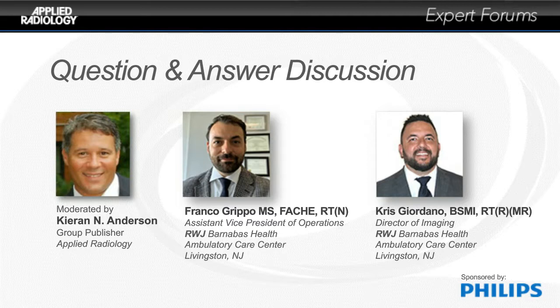We scan the documentation into PACS on what that particular MR conditional implant is. We actually screenshot the ScanWise entry so that we have a forever legal record of what we did to ensure patient safety. So the short answer is yes, it does help expedite that intake for that patient. Thanks for addressing that, Kris.